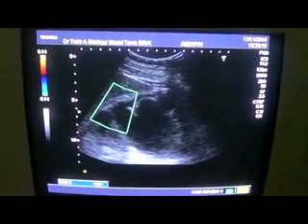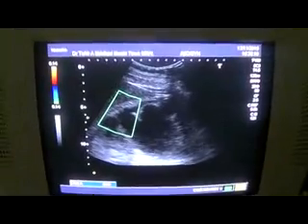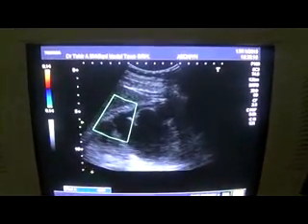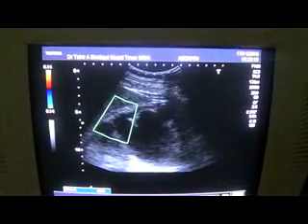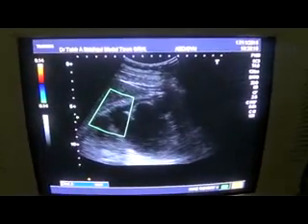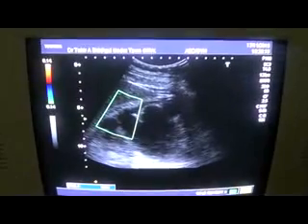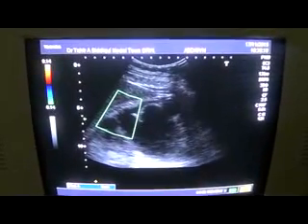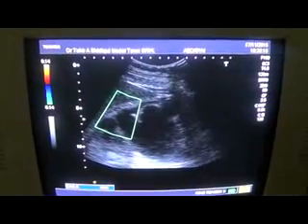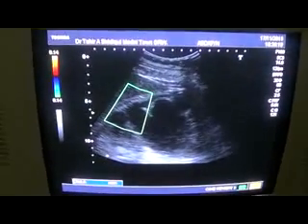This is an ultrasound study of a 45-year-old male. He had removal of the calculi from the right kidney, and later the ureter was implanted and a stent was placed, which has been removed only 1.5 months back. Now he is having pyuria. That is the only finding and history that I have.